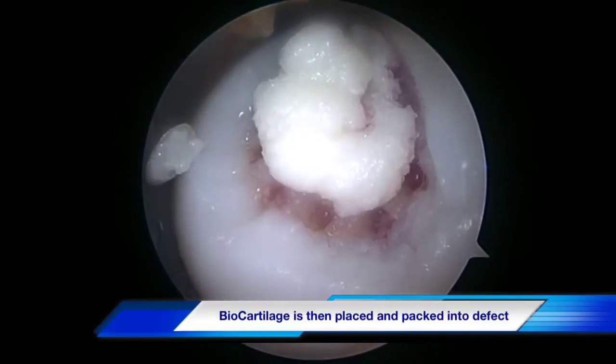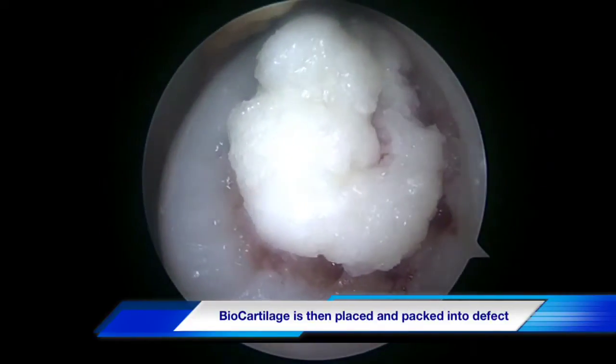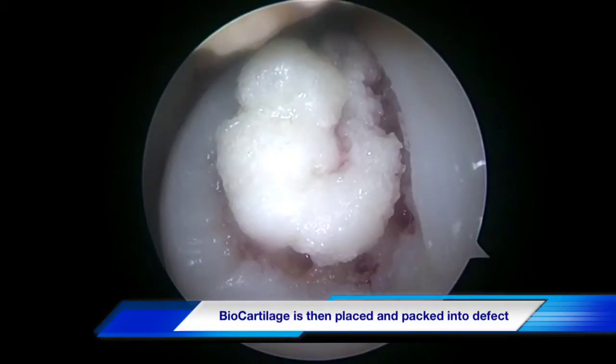The graft is then packed into its bed and placed just below the level of the native articular cartilage.